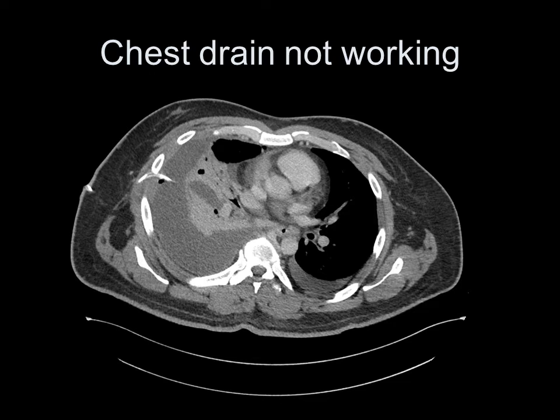But a very significant amount of the time, this pattern here is produced by atelectasis from the pleural effusion, which compresses the adjacent lung and collapses it down. This is an almost universal finding in large pleural effusions, but unfortunately people continue to call this consolidation, and the fact is that it isn't. So we have to judge the size of the effusion and also the same collapse consolidation signs when we're assessing this, but we should really be alert to the fact that large effusions will inevitably cause atelectasis in the adjacent lung tissue.